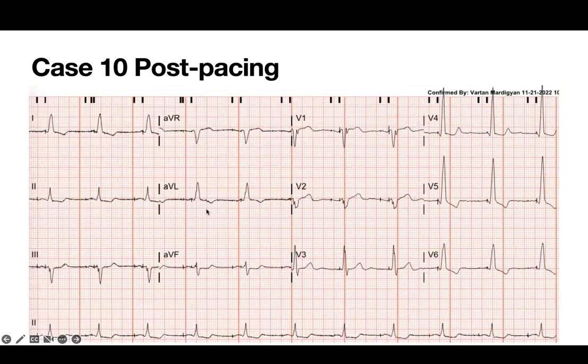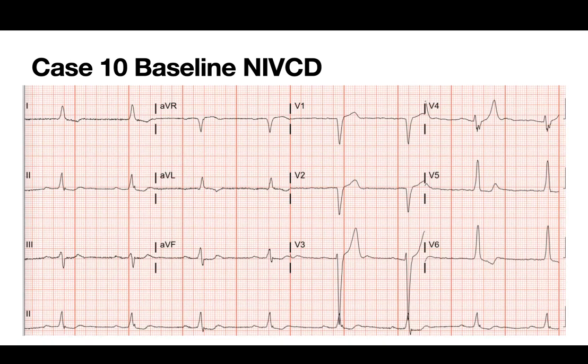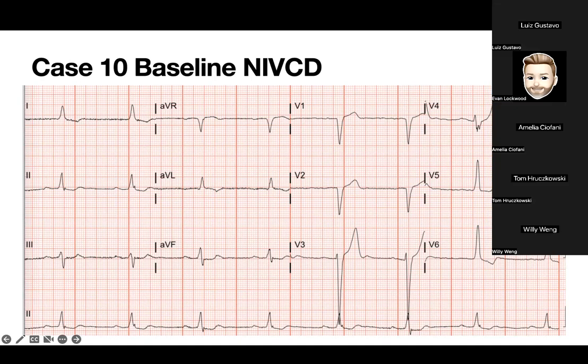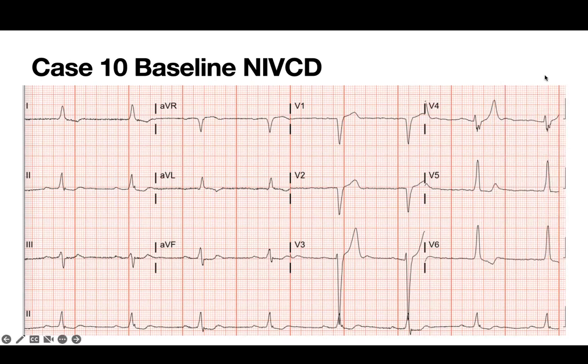Are you guys measuring LVATs in the EP lab? Yes, in the lab, spike to peak in V6. Well, the only reason I ask is that we can't do that in all of our EP labs, depending on where you're booking these cases. I just wanted to see if anybody else has the same issue. I don't do it in an EP lab. It's equivalent. I use the system in the cath lab. And then if I have to do a case, I come in. I'll show you. I have a setup: I do a 6 lead, and you can go on 2,500 milliseconds and you can do all the measurements. The room is like a cath lab setup, but you can do all the measurements.